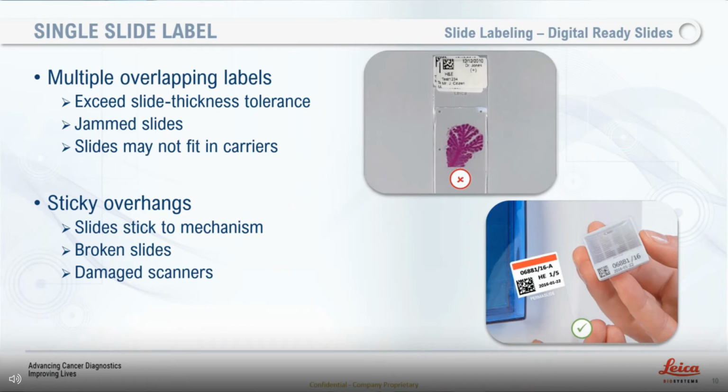And again, this is going to be very scanner dependent, and looking at how different scanners and different models move the slide from whatever kind of either slide tray or slide carrier it has and puts it in under that objective for high resolution scanning. And there are a number of different methodologies involved, whether it's a push-pull mechanism on the slides. Some scanners have little grabbers where they pick up the slides and move them. Others put them into little clip-based slide trays for moving into that kind of under the objective for the high resolution scanning.